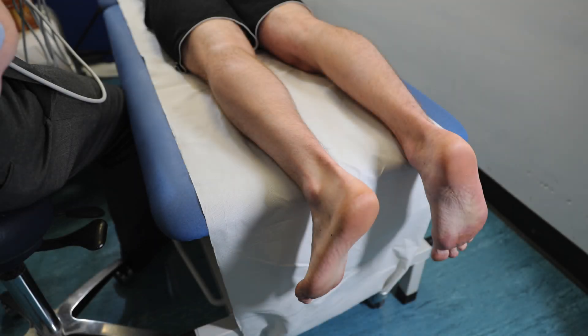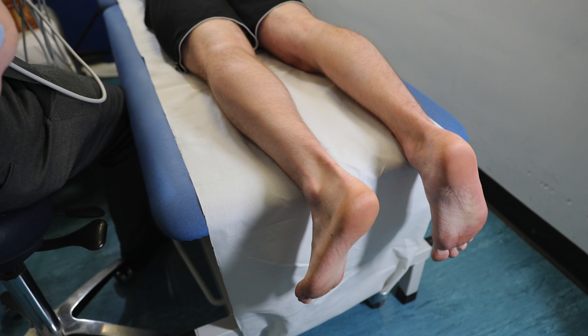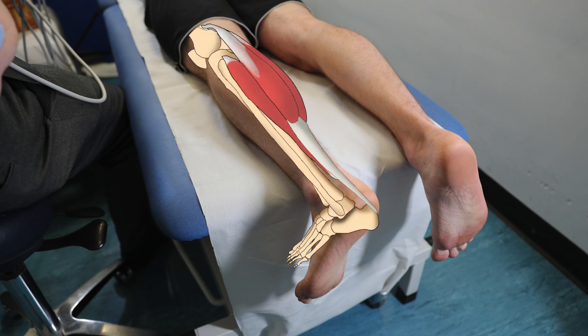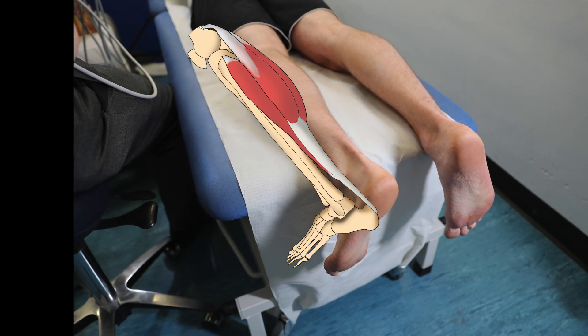We recommend that the patient lies prone with their feet hanging over the edge of the bed. This position makes it easier to scan the Achilles tendon with both passive and active movements.